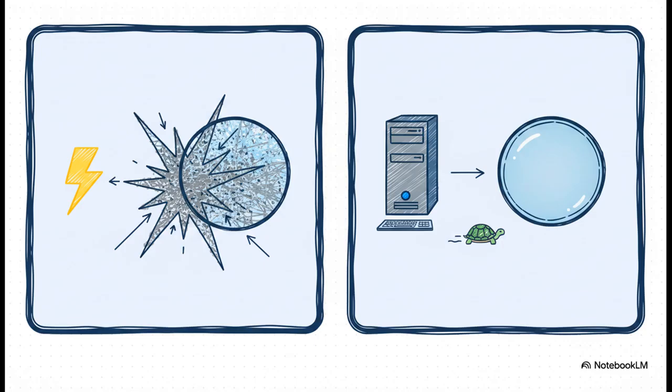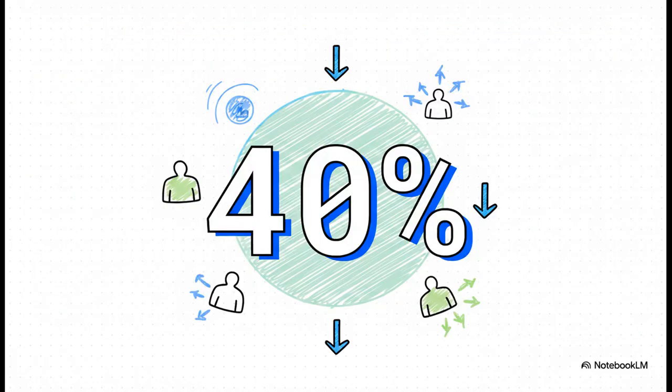It's slower, and honestly, if you push the algorithm too far, it can make the tissue look weirdly smooth or kind of plastic. Now, what is really interesting about this is the number on your screen. Because iterative reconstruction is just so incredibly good at cleaning up image noise mathematically, it means we can drastically lower the amount of radiation we shoot into the patient. Switching to IR can actually give you a dose reduction of around 40%. Seriously, highlight that 40% number in your exam notes right now.